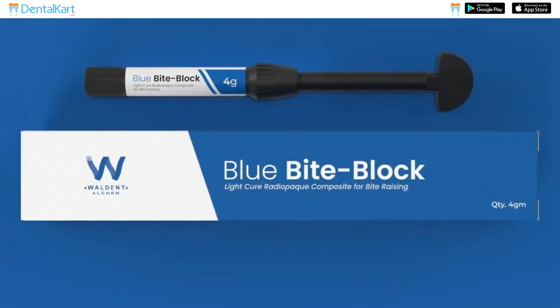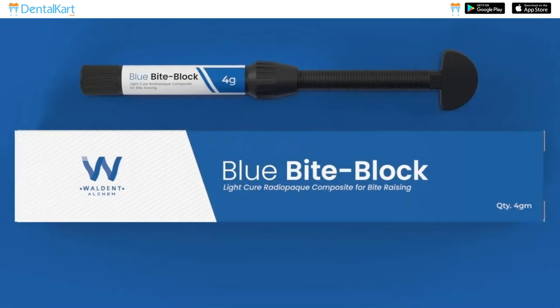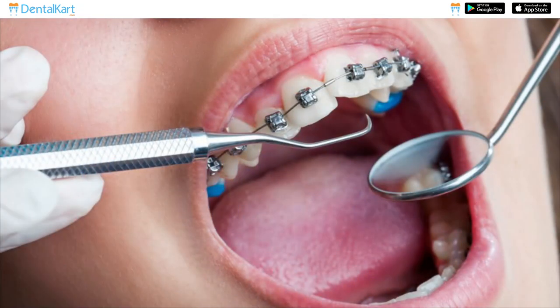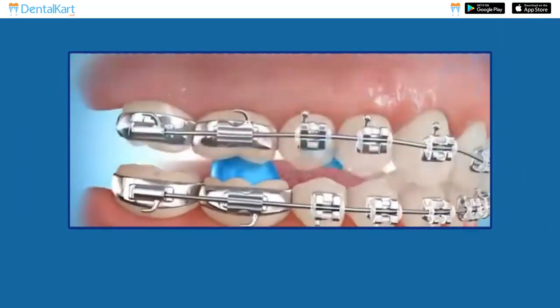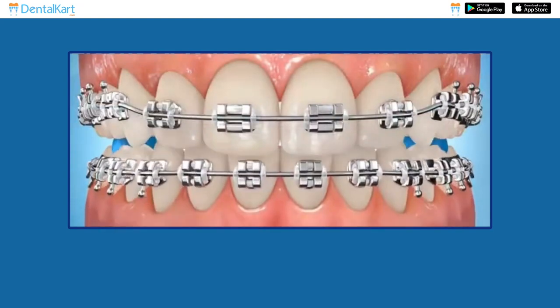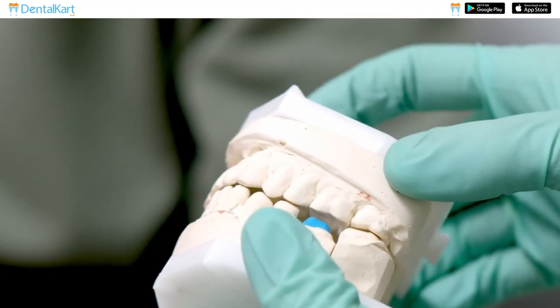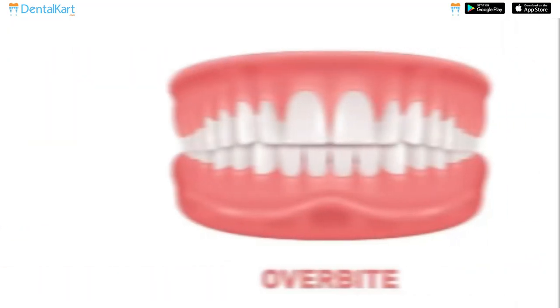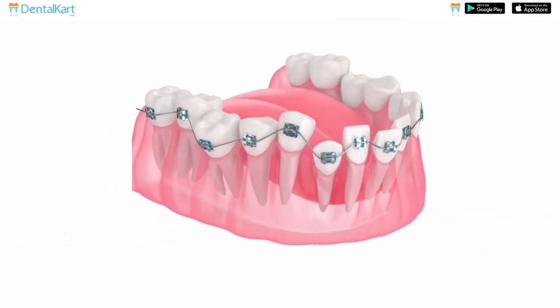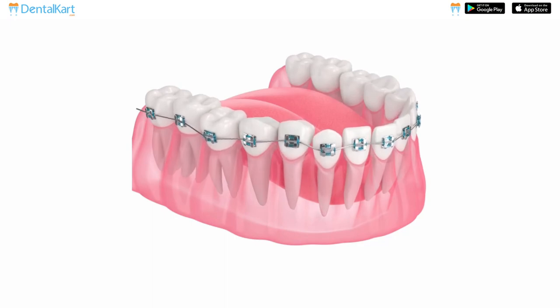Walden Blue Bite Block is a visible light cured, radio opaque composite restorative material that is commonly used in orthodontic treatment to temporarily raise the bite, prevent bracket damage, and eliminate occlusal interferences. They are especially useful in cases with deep overbite and crossbite, facilitating unobstructed tooth movement and allowing for effective bracket bonding.